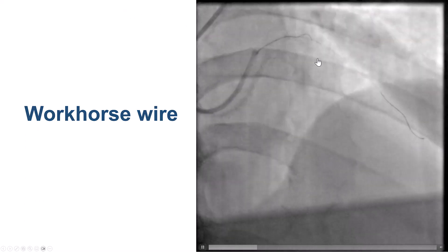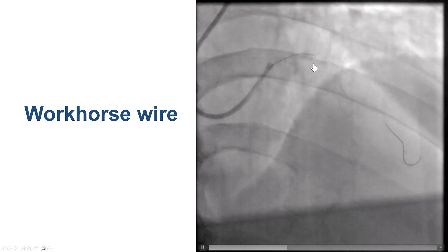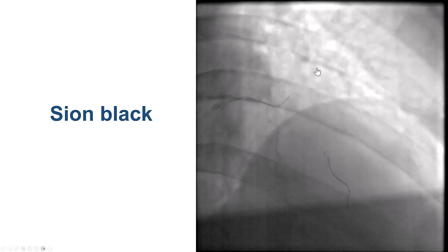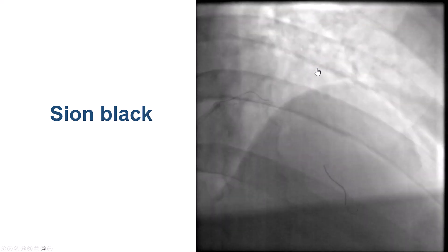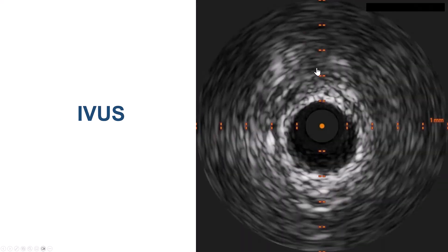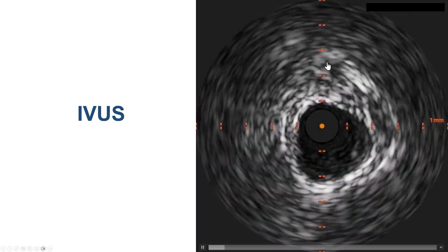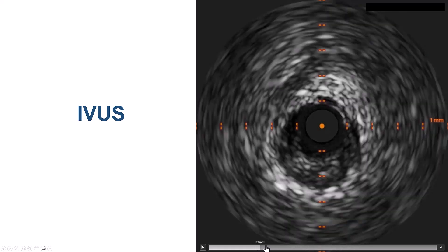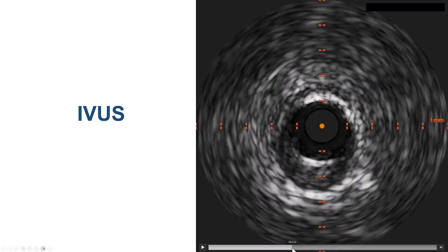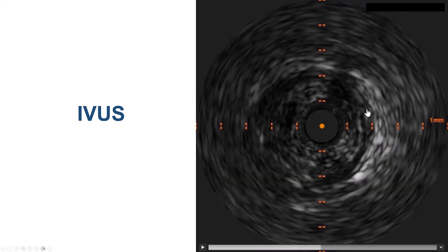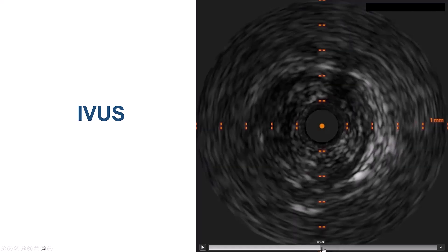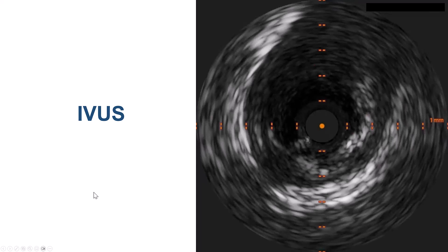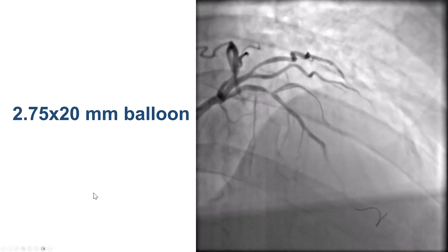We wired the LAD and then had some difficulty wiring with a workhorse guidewire into the diagonal branch, but then a Sion Black wire went into the diagonal branch relatively easily. We did intravascular ultrasound in the LAD which showed some disease distally with mainly soft plaque, and then mainly soft plaque at the area of the bifurcation with some disease proximally. Very minimal calcification, exactly as shown on CT.